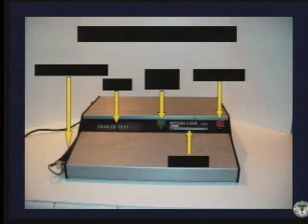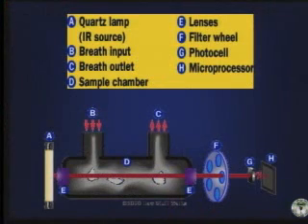We talked about some basics in Part 1 on the machine itself. That's what the Intoxilyzer looks like for those who didn't see Part 1. If we go forward, I think 2 slides, let's talk for a minute about the components again. Your left end of the screen is the light source that shines through this sample chamber. So that tube there with the pipe sticking up it is the sample chamber. And the light is received at the far right end, and if there's nothing in there other than clean air, it gives a reading of no alcohol.